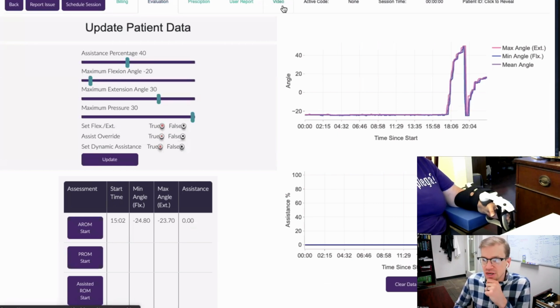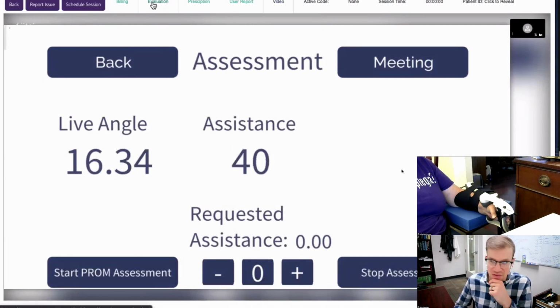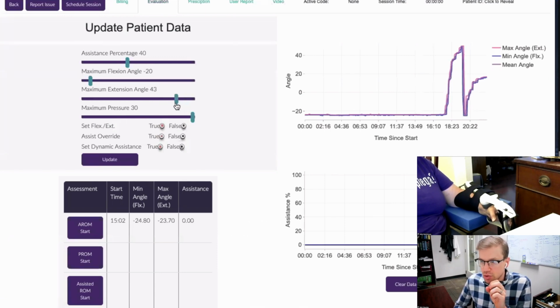Very, very common. But I'd say that this is really encouraging though, Polly. I think the fact that you're getting some movement into extension with those levels of assistance is really good. You've got good available range of motion. And so I'm going to make a couple of modifications here to our values.